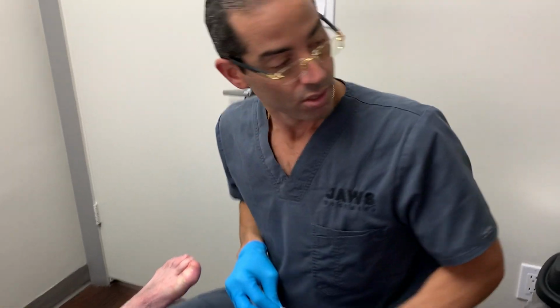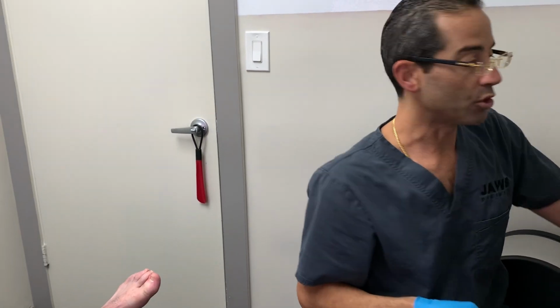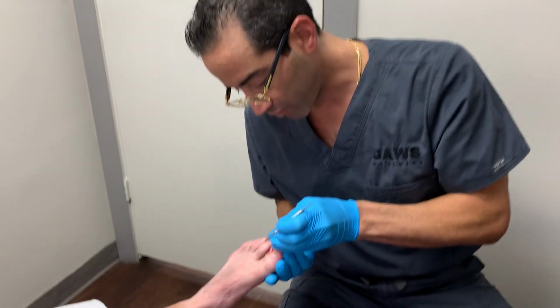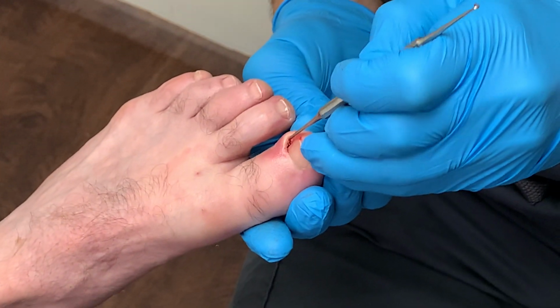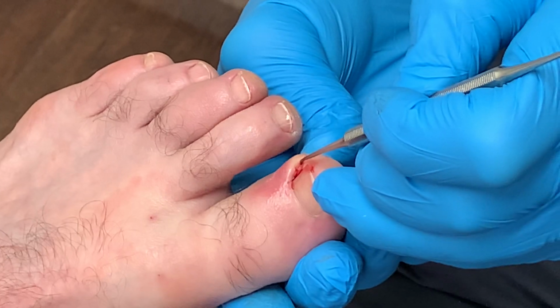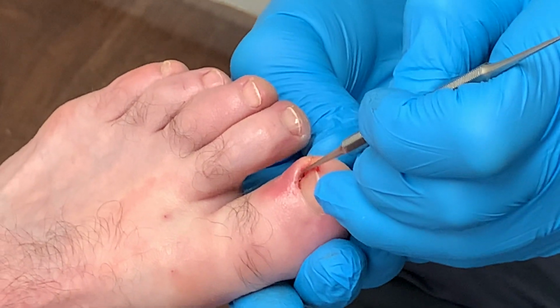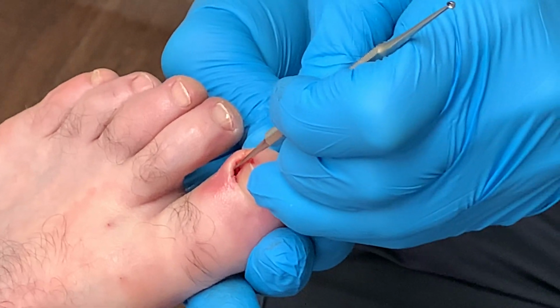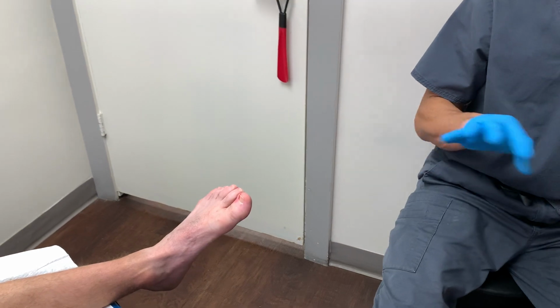Okay. So again, we can use a curette as well. Sometimes the curette, just to check. Again, very, very important. And I can feel them. You see, this is the pocket where that little shark tooth was hanging out. And I suspect that on a scale of 1 to 10, 10 being the worst, you were hovering at a 9 or a 10? Yes.